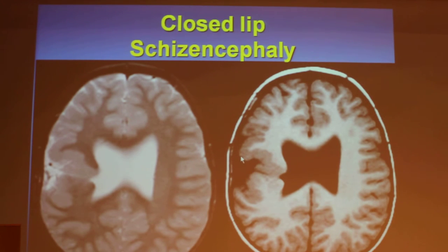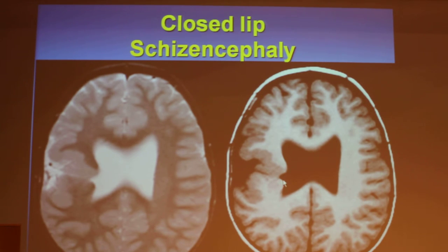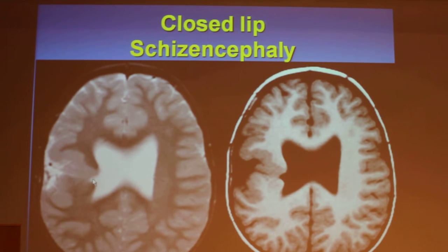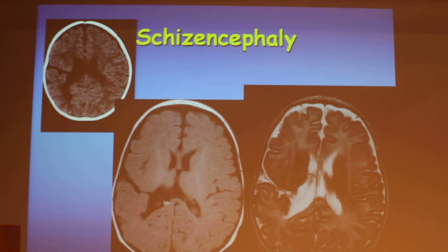When it is closed lip, we have to look for signs because sometimes we can see it and sometimes we just have clues. One of the clues to look for is the ventricular nipple — an outpouching from the lateral aspect of the lateral ventricle that leads towards the cleft. Sometimes the cleft is closed, but if we look closely, we see that it is lined on both sides with gray matter, which is of course easier to see if the cleft is open.